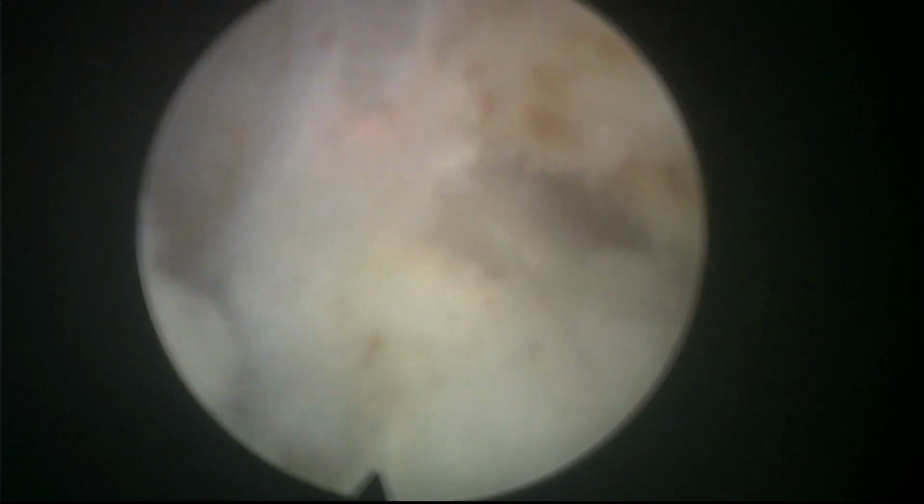So there, again, you see, following the contour, following the line is a good idea. You can see that I move usually, I don't do very small movements, but I try to do wide movements, you see, going all the way up. So the philosophy is to try to release maybe a little, but then take this little up and around, so that you can develop a nice circumferential line.